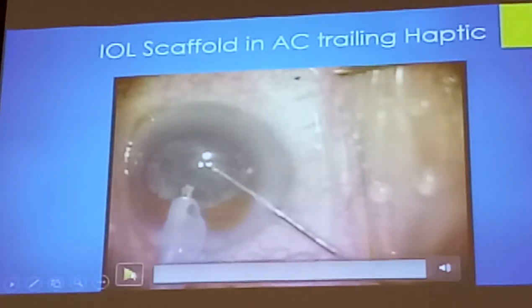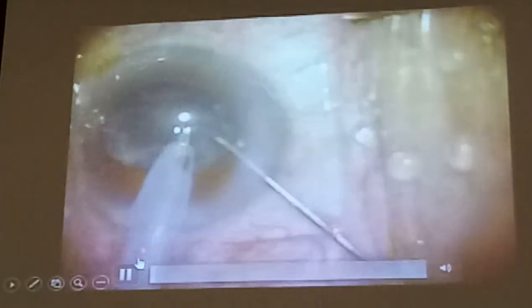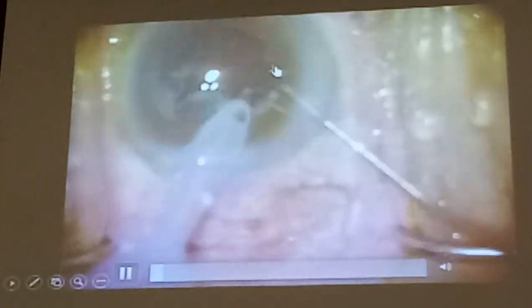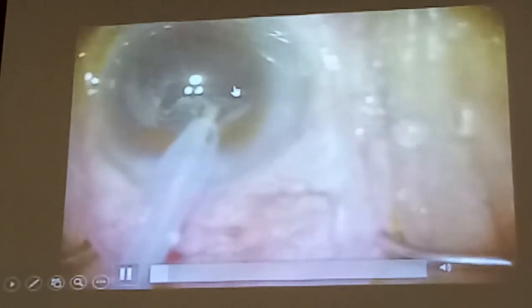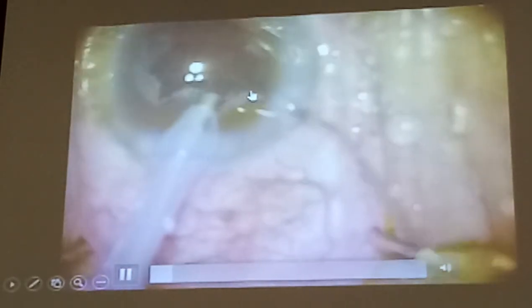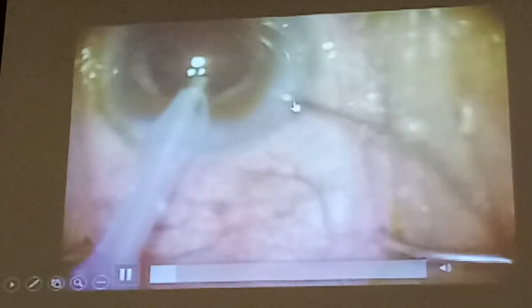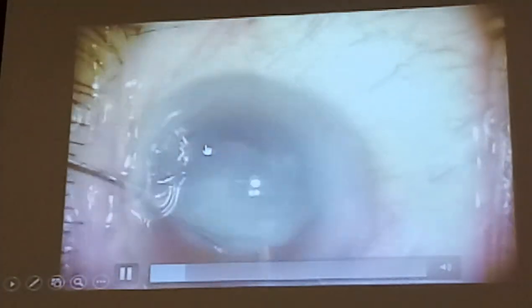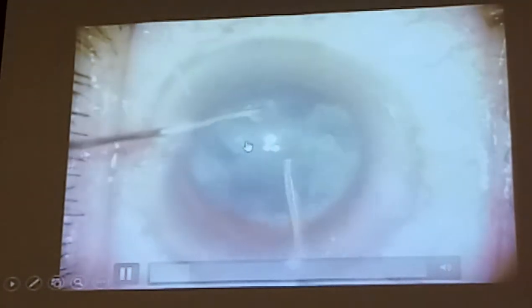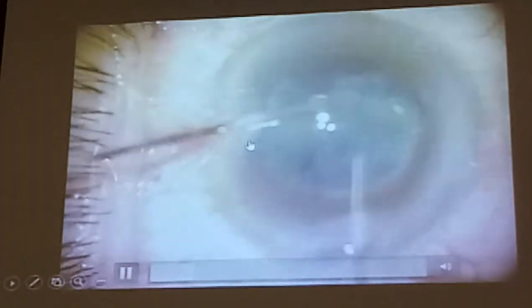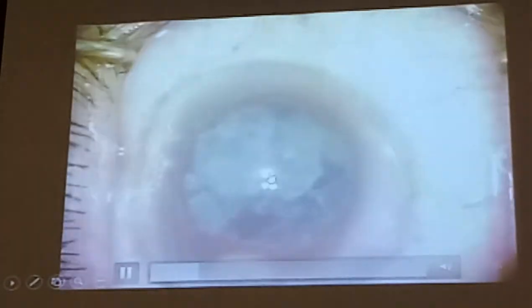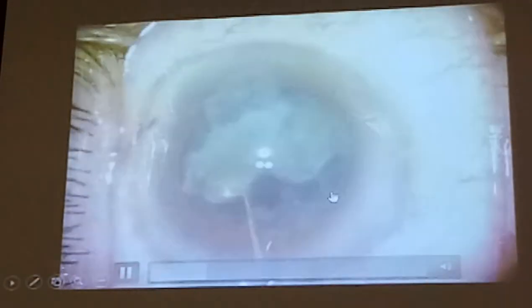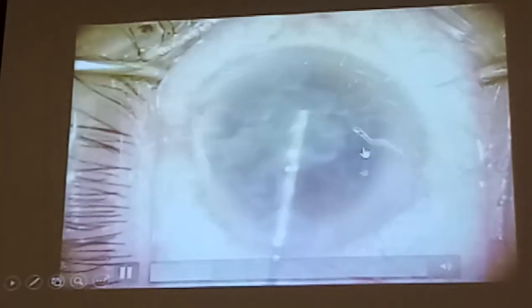Now we're going to have another case — it was not started by me; I was just called in. You can see this is a left-handed surgeon and suddenly she runs into trouble. Something looks like it's dropped — maybe, maybe not, but it's very suspicious. She's doing the right thing — you can see the hand shaking. Put in dispersive viscoelastic last thing, then come out. So I was called to help. I don't know what happened before. We have these fragments to remove coming out from the capsular bag. I use this mushroom instrument — also designed by Graham Barrett — it's a blunt one so you can put it into the capsular bag, mobilize the nuclear fragment, and lift it up into the OVD trap.